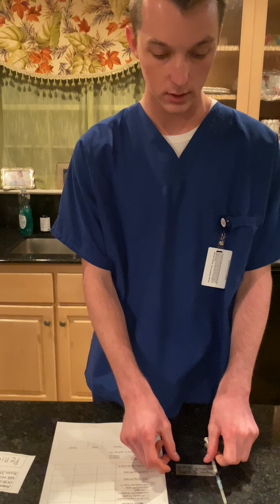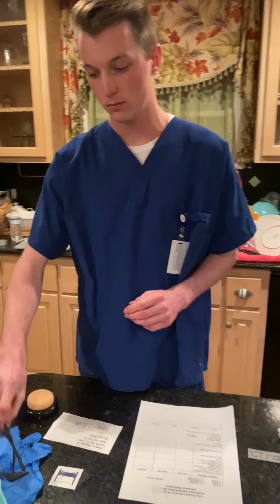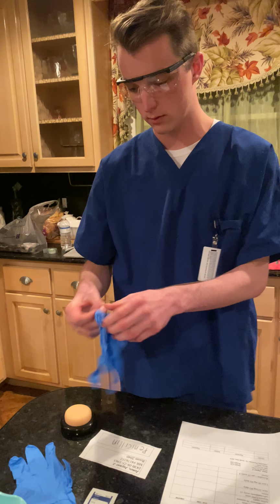So then I will explain the procedure to the patient. I want to give you an injection of regular insulin in the upper arm. It will just be a small prick. So I'll do hand hygiene, put on the goggles and gloves.